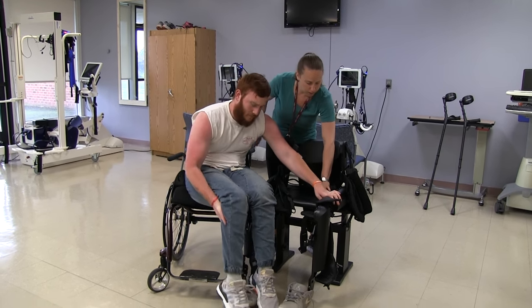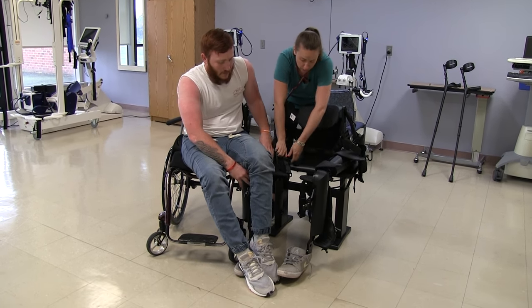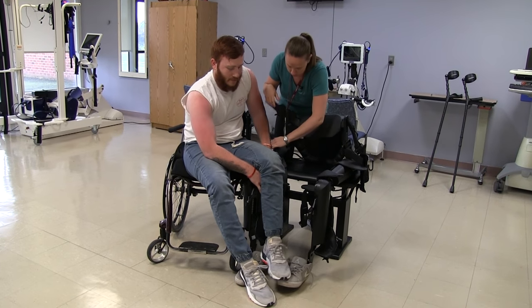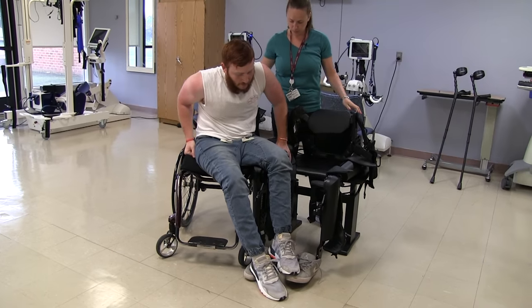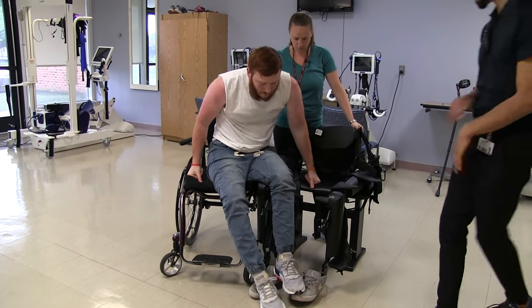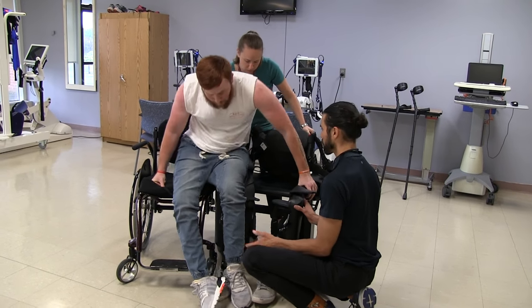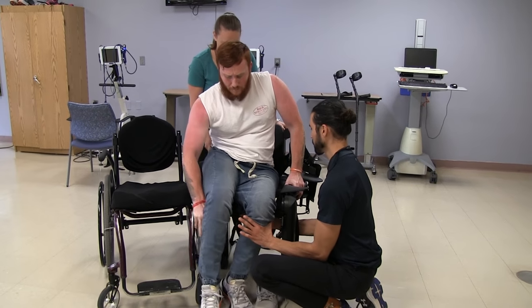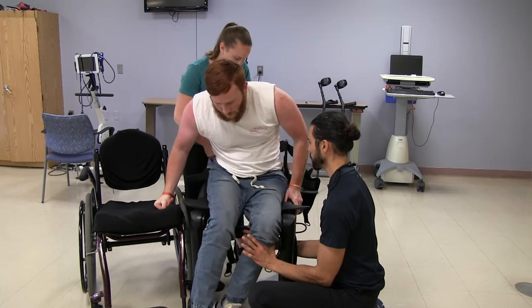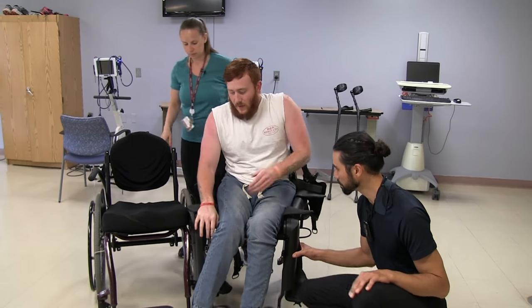Hold on one second — the clips were not unclicked. After fixing that, Keith continues the transfer. The therapist guides him: lift up and there you go. Very good. Great transfer.